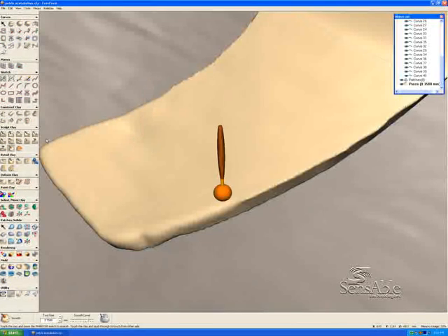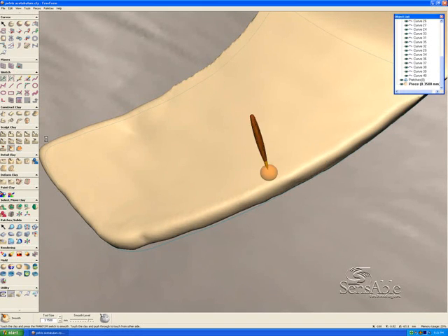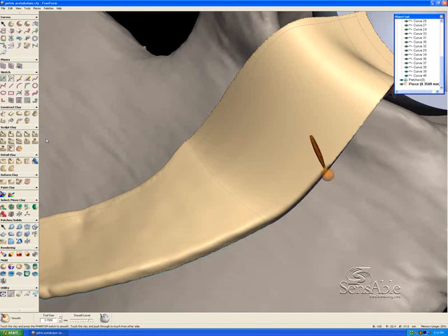Now this was a very straightforward layout method for the tab here. In terms of its shape, it's very rectangular, but the options are limitless in the type of geometry that could be created here. The usefulness of this model immediately can be seen with the use of rapid prototyping machinery.